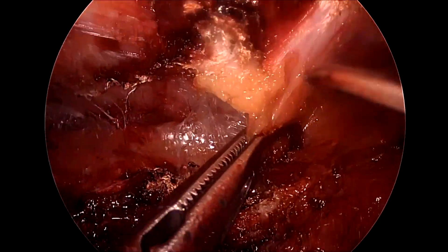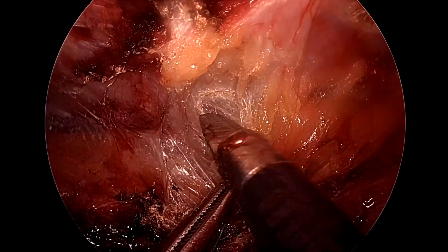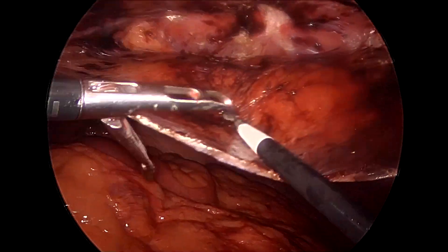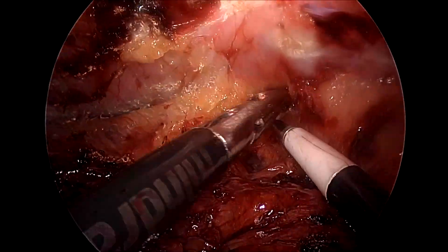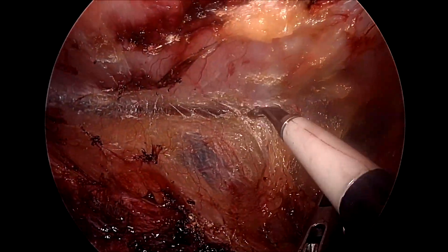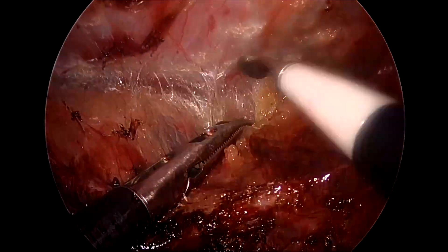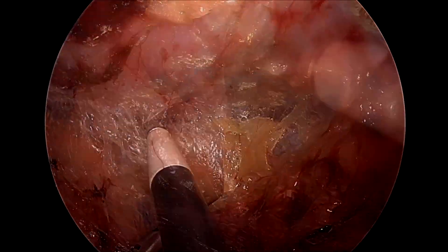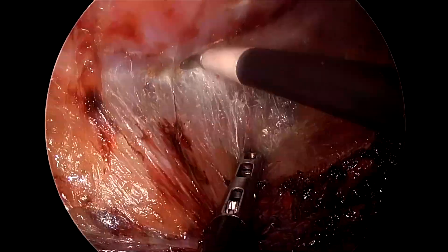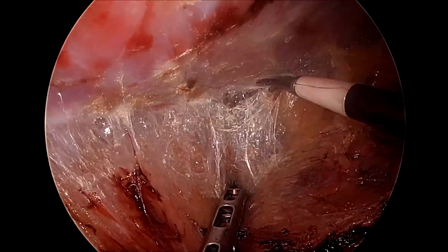Once we have completely taken down the hernia defect and the pseudosac, we move our dissection onto the contralateral side. When we start working on the right side away from us, we usually prefer changing my instrument again from a sharp scissor to a spatula.